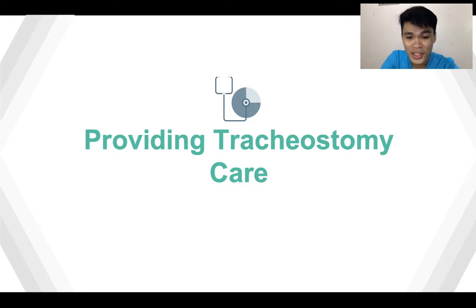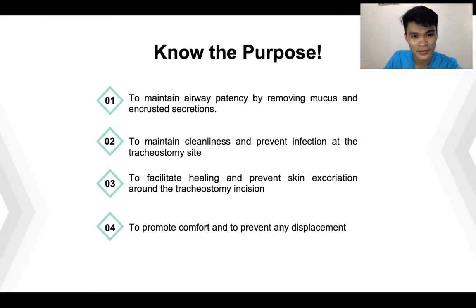Tracheostomy care is one of the basic skills that a registered nurse should know. Learning how to do tracheostomy care is hard and complicated at first, but with proper knowledge and practice, we are able to master the skill with ease. Before performing tracheostomy care, we should know the purpose itself.